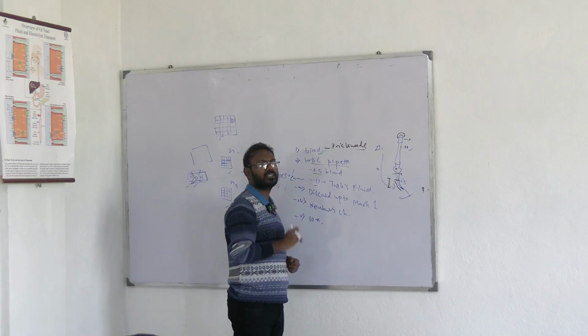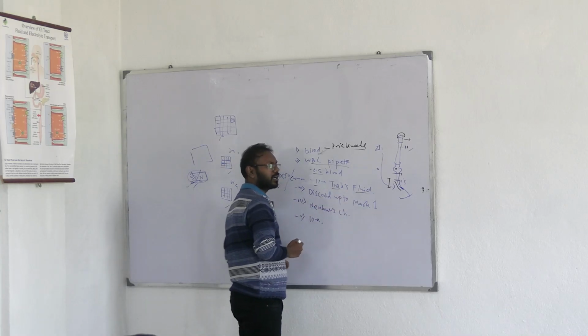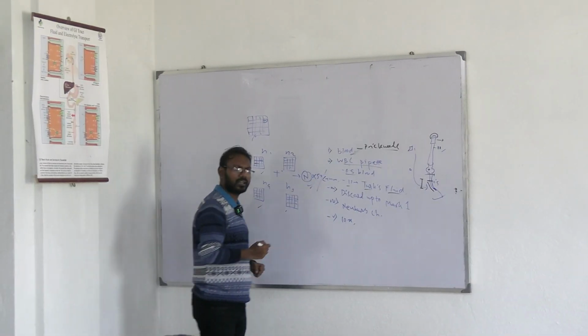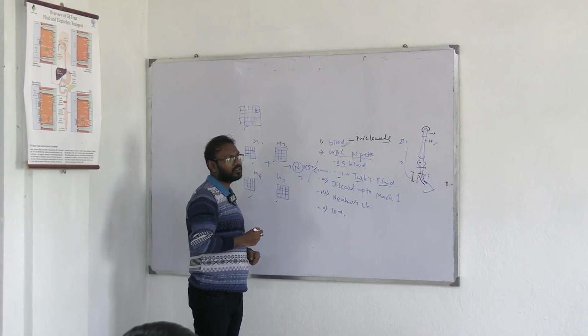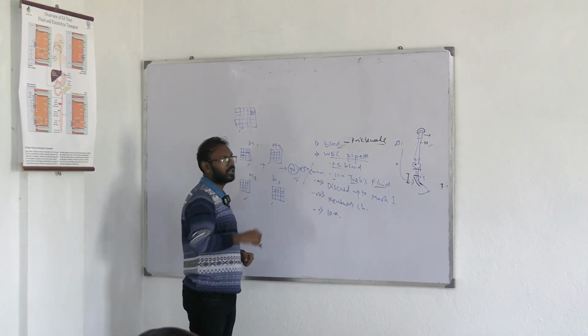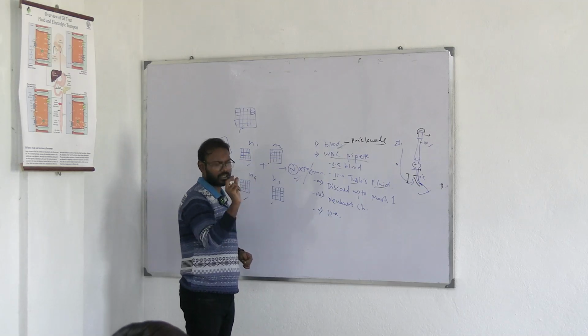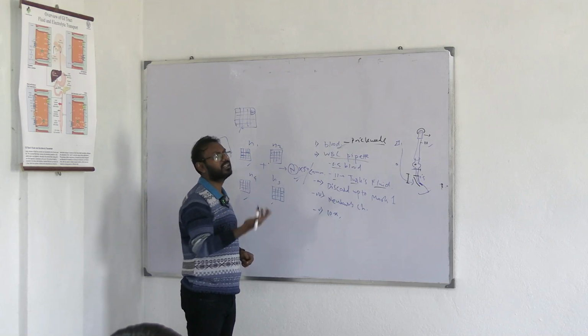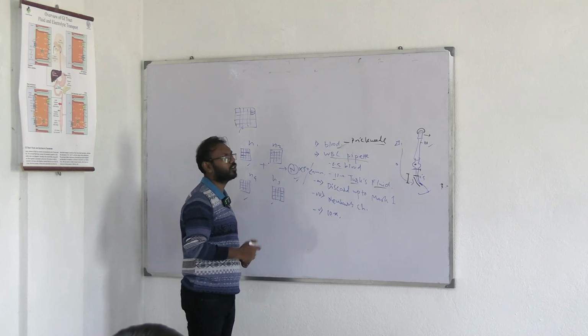In case of RBC counting, the fluid's name was Hayem's fluid. In case of WBC you have Turk's fluid. The compositions are glacial acetic acid and distilled water, and for staining, any colored name like Gentian Violet, you will understand that is for coloring, that means staining of the cells.